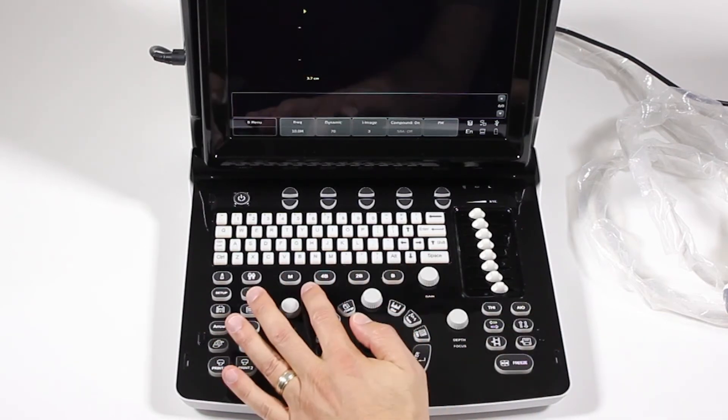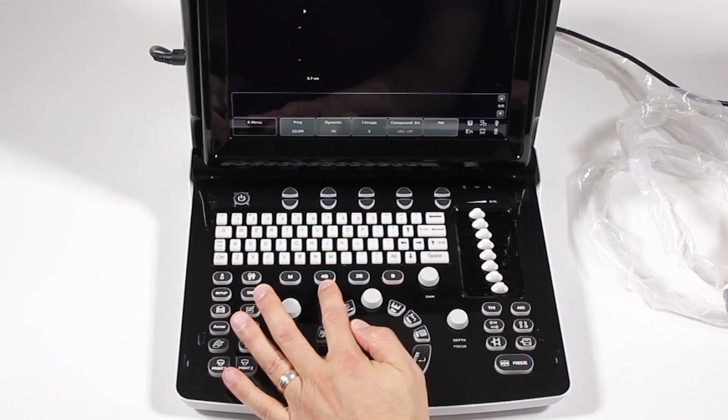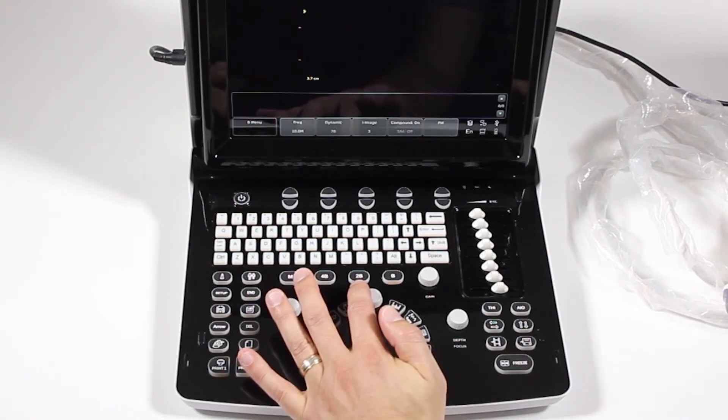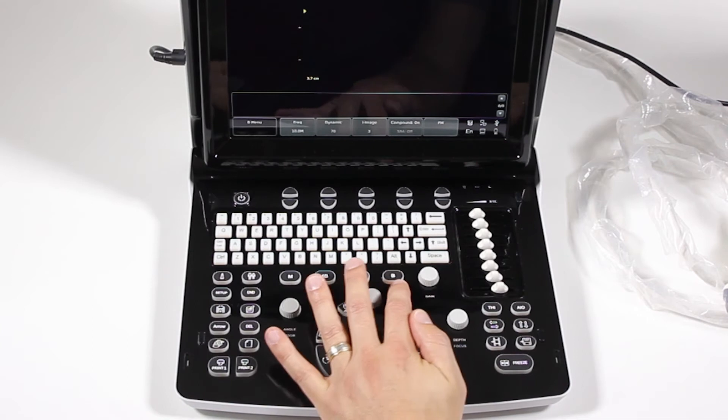Here are the imaging modes. We have M mode, 4B, which is quad screen, 2B, which is dual screen, B, which is 2D.